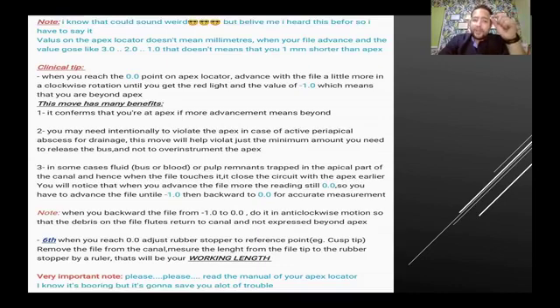When you're reaching the apex and you find 3.0, 2.0, if you stop at 2.0, that doesn't mean that you stopped 2 millimeters short of the working length or the apex. These numbers don't mean millimeters.